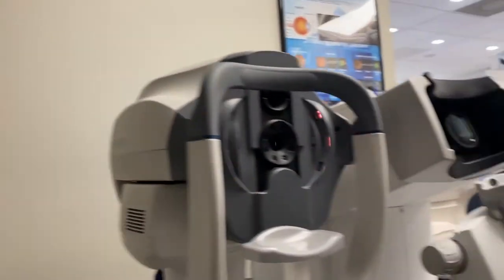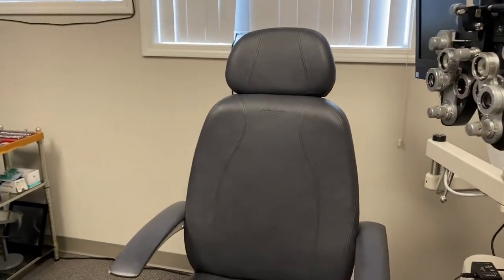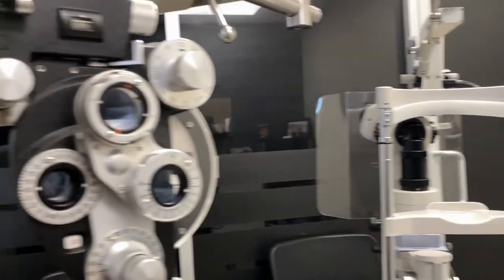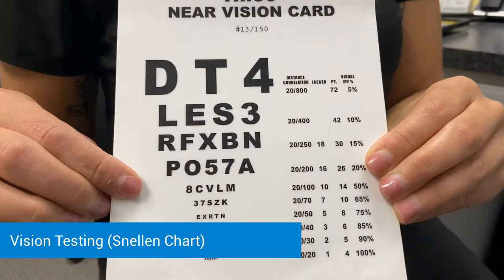Moving on, we're going to head into the exam room. You can have a seat in the chair. I'm just going to check vision next — first we'll check vision up close. I'll have you hold this card where you're comfortable reading and tell me the lowest line on the left hand side that you can read for me.